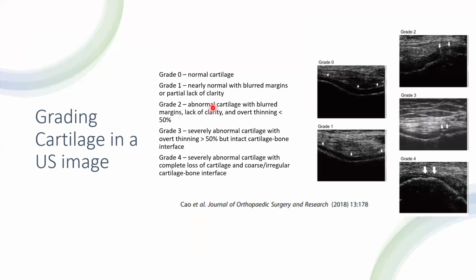So you can measure thicknesses of the cartilage and compare them to what we knew from the previous video. In the middle of that sulcus, it should be about 3 millimeters, tapering down to closer to 2 millimeters on the medial and lateral side. And then when you look on the condyles, it should be roughly 2 millimeters there as well.